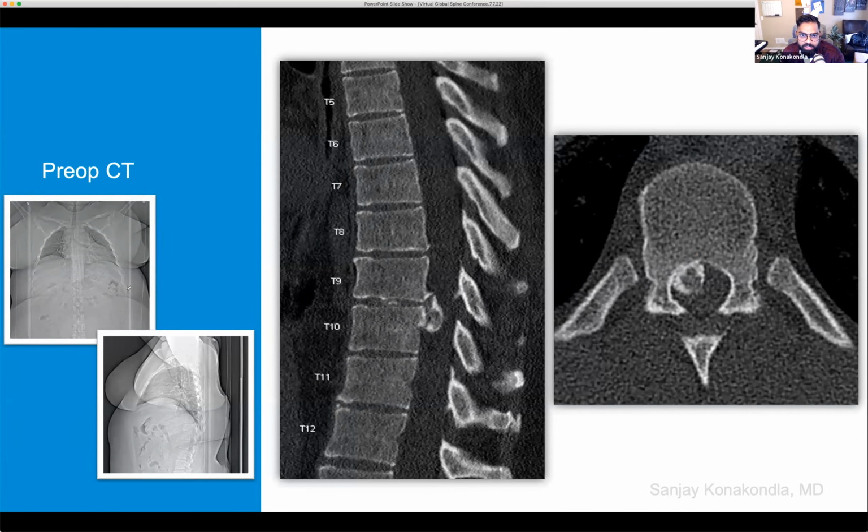The scout images are there because it gives us an idea of the challenges of any type of thoracic approach to this disc, whether it's lateral or transthoracic or transpedicular or anything. But we tried to do this endoscopically. So clearly all calcified, and it's just not okay to say it's calcified. It has this calcified rim. And also, if we translate this laterally, the pedicle's here, right? So it's probably in this orientation. So it's behind the pedicle.